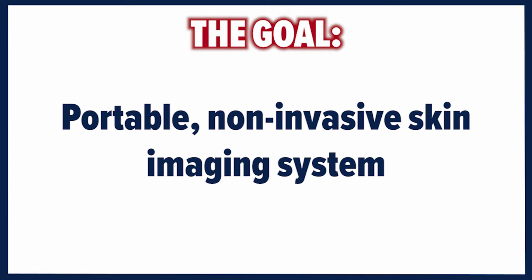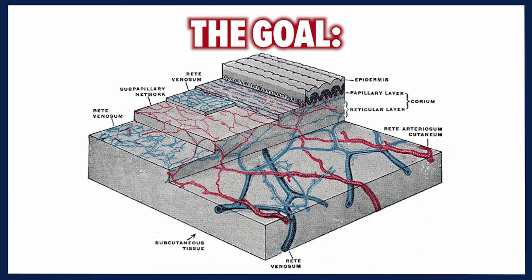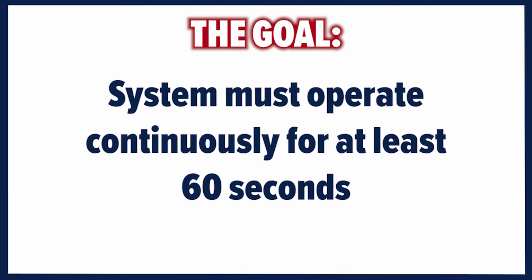The goal of this project was to develop a portable, non-invasive skin imaging system that captures at least 250 frames per second in order to observe physiological processes, like blood flow or sweat production, in a time frame varying from a few seconds to 1 minute. Here's Dominique to explain further.